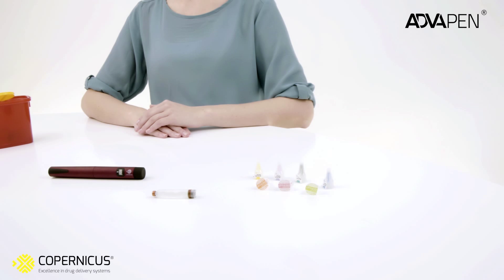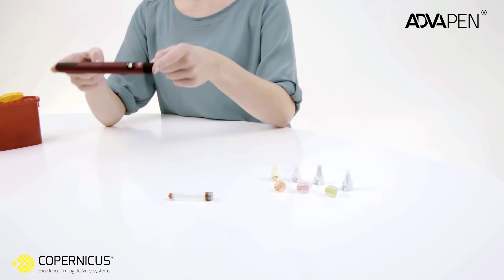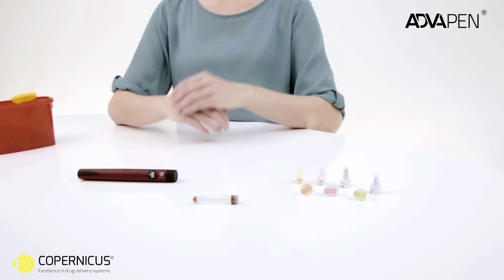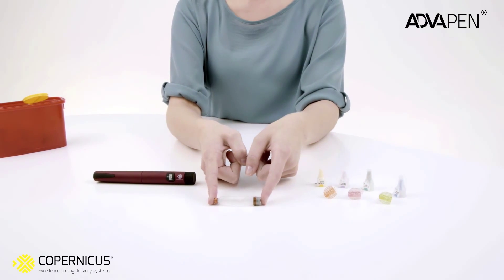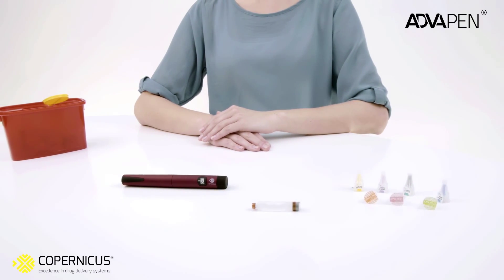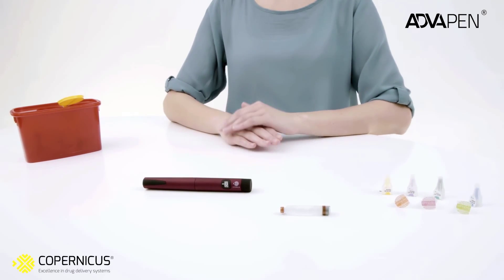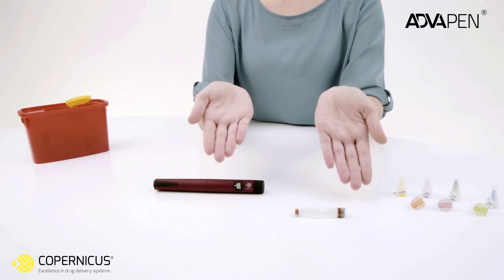In order to start using the Copernicus automatic pen injector, you must have the pen injector, the insulin cartridge, a pen needle, and a container for disposables. Make sure you have washed your hands before you start using the pen.